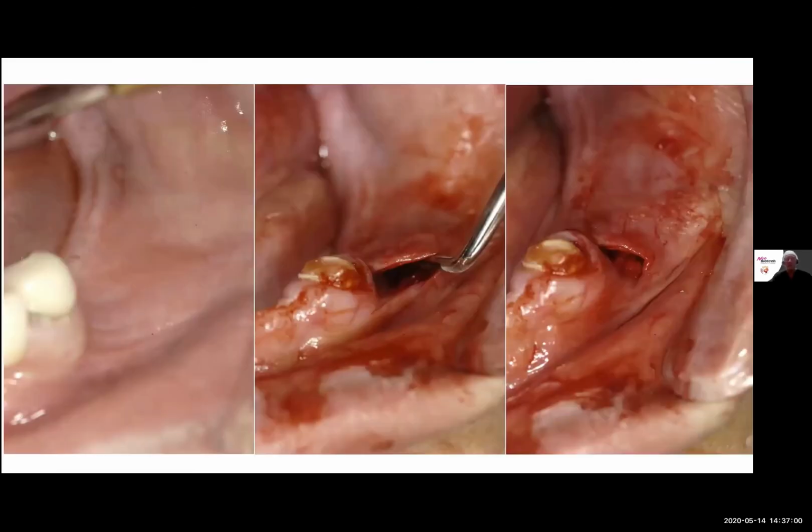In a distal extension, where we're missing teeth to the entire distal of that, we're going to create again a window that's going to come in, and our window is going to extend. An initial incision is going to come here, and then we're going to extend this down and out to the facial surface of this. Typically, like I said, it's almost always the facial surface that we're losing bone, and this technique is the process that we're going to grow bone right in this area here to make it wide enough that we'll be able to place our graft.